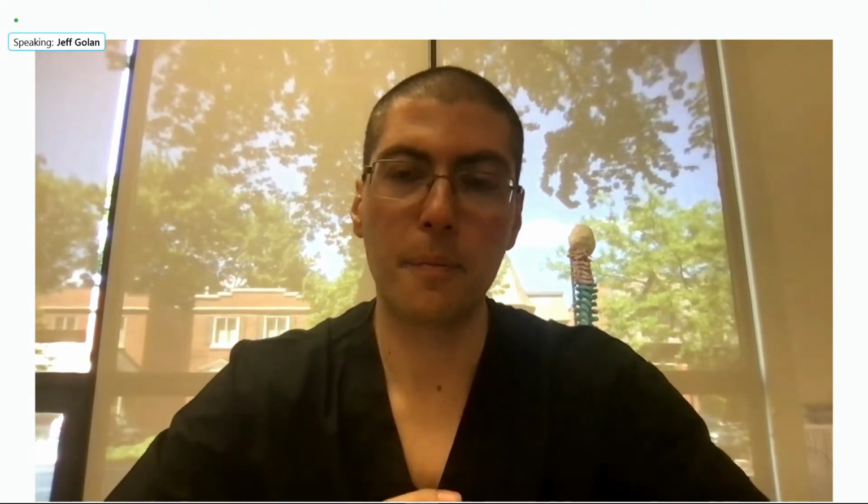That takes a little bit of getting used to, but like everything else, once you get used to it, it's a tremendous help. Yeah. Great, and I imagine also to finalize this question, if you go on the other side, you take maybe a different set. Do you take the stenosis set in that case? Like if you do a bilateral decompression, I imagine, yeah. And why? Yeah, I find it's easier. The drills are bigger, and I have a bigger view of the anatomy. So I prefer the stenosis set for those cases.